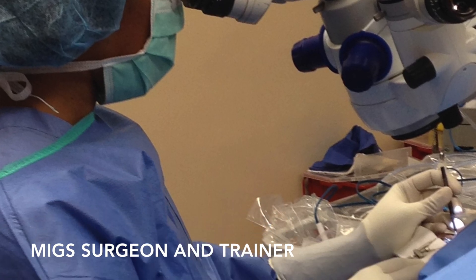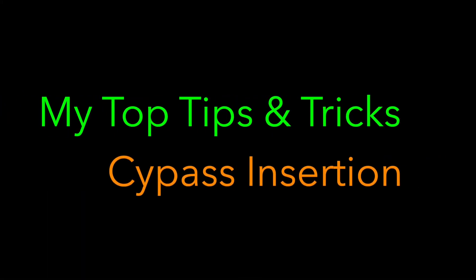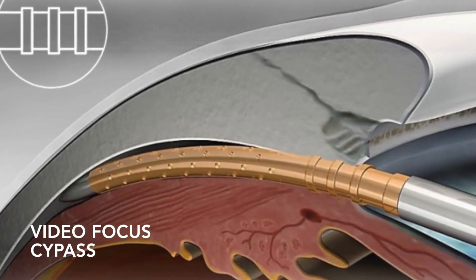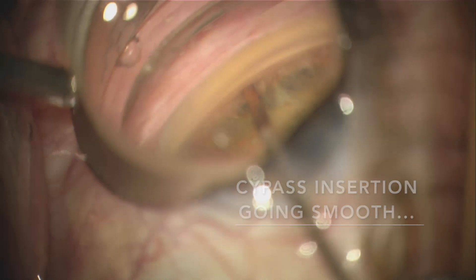Hello, my name is Dr. Constance Okeke, and like many of you, I am a MIGS surgeon. Over the last eight years, I have performed several different types of MIGS procedures, and there can be a place for all of them. But today, I'd like to share with you some of my top tips for CyPass insertion. I'll first review my nine steps to successful CyPass surgery, but stay tuned for useful tips along the way, and at the end for highlights, where I'll show you how you can avoid postoperative pressure spikes, how to avoid the creation of a large cyclodialysis cleft, and how to avoid a not-so-good reaction to the CyPass insertion.